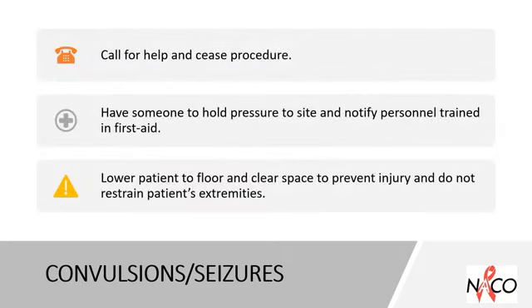It is better to make a note of such occurrence on a requisition form. In case of convulsions and seizures, call for help and cease the phlebotomy procedure. Have someone hold pressure to site and notify personnel trained in first aid. Lower patient to the floor and clear space to prevent injury and do not restrain the patient's extremities.